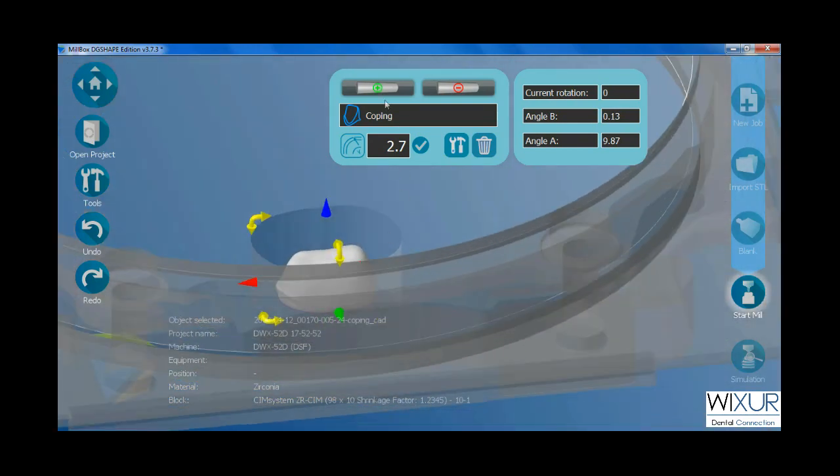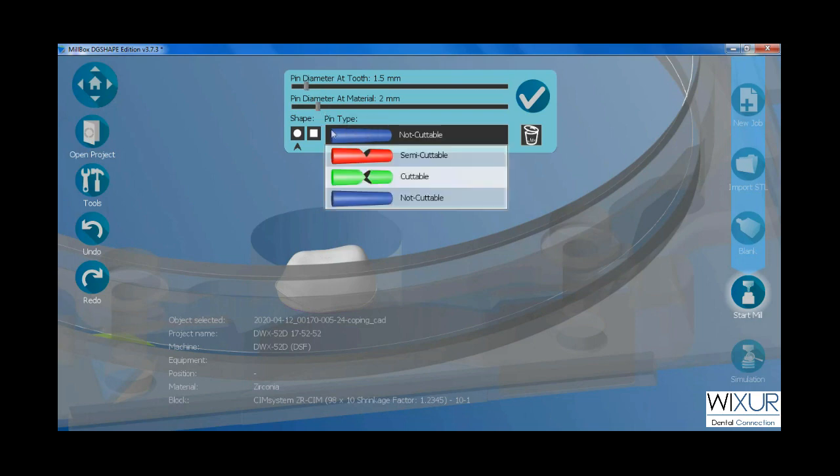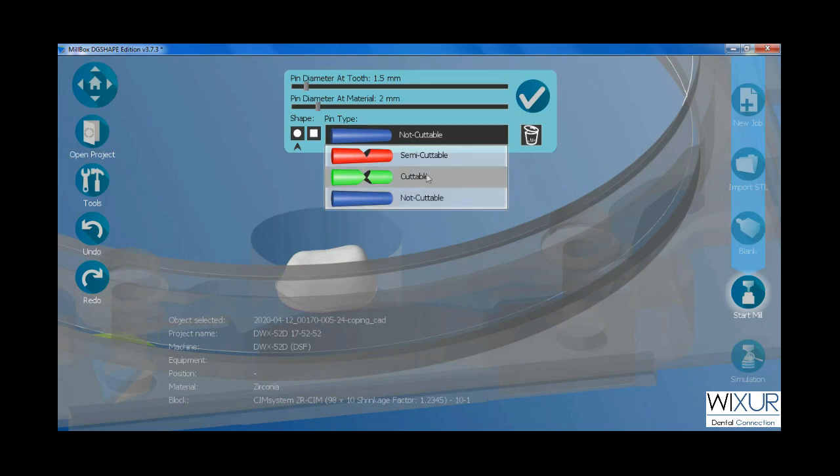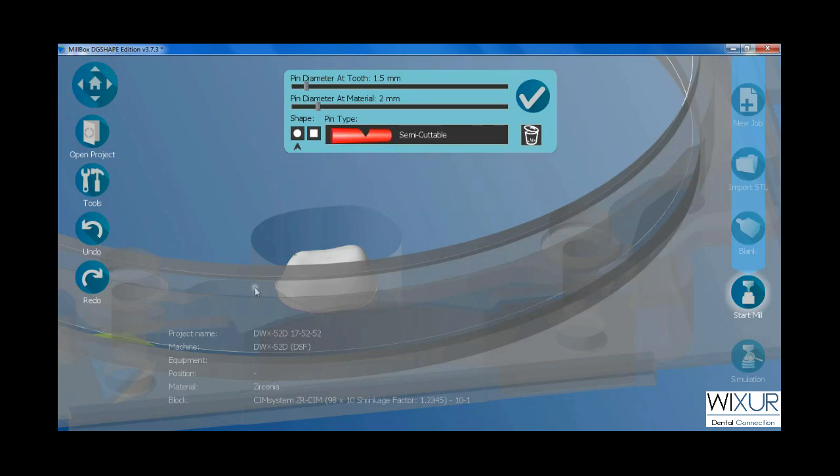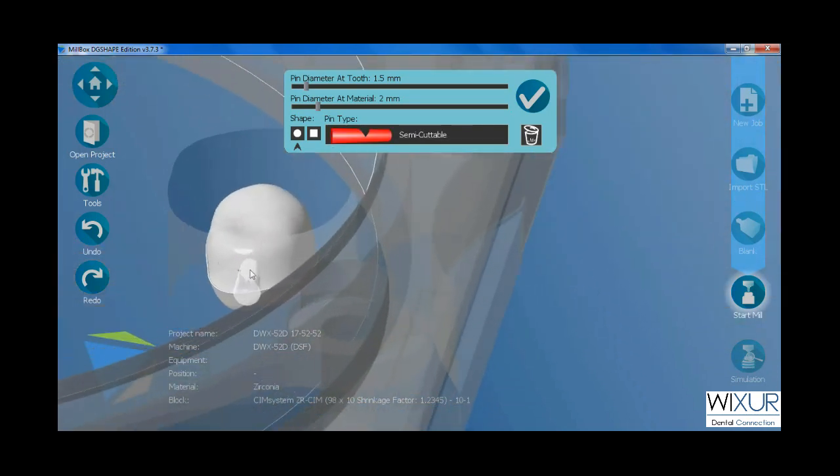When the placement is done I should start defining the connectors. Choose the connectors diameter at tooth and at material. There are 4 different types of pins in this software based on the cut size. With left mouse click, put the pins on the crown.